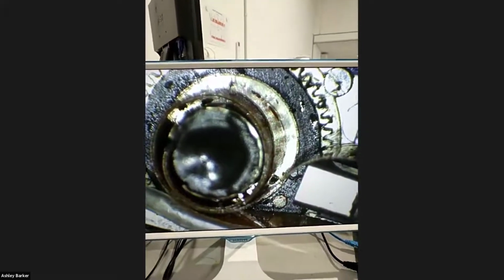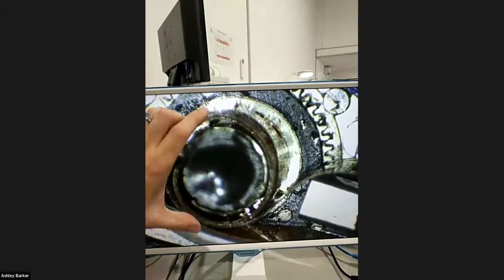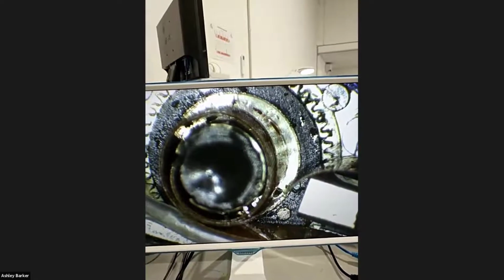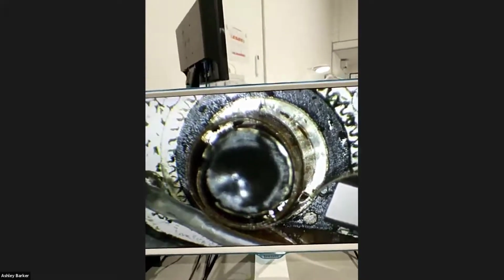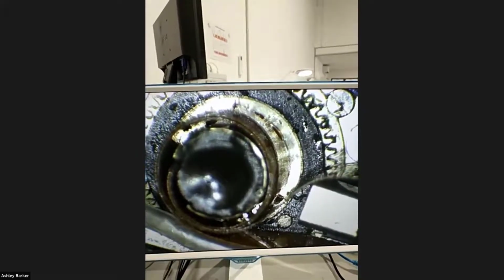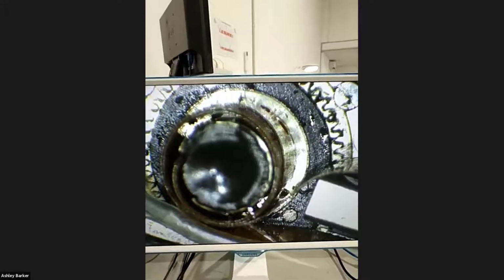And bear in mind that the end of that, much, much bigger than the screen we're looking at here, is only 10 millimeters. So they're really, really tiny. It's the first time I show people who work in hospitals sterilizing these sorts of probes, and they get a whole lot more respect for it, because they realize there's a lot of little tiny bits in the end of these.